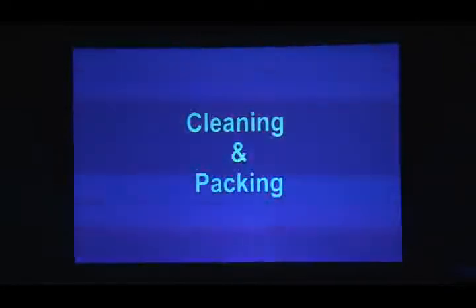The end of that topic. Surface disinfectant. No, actually, we just showed that fogger machine. Actually, fogging is not recommended, not needed in the OT. People used to do this fumigation also. Actually, that is also not necessary. Meticulous wiping of all the surfaces of the theatre is enough.